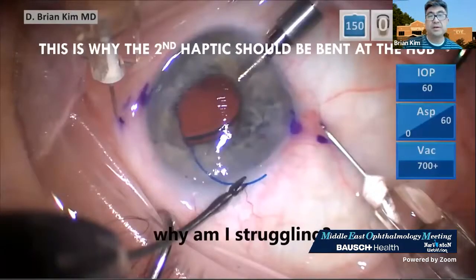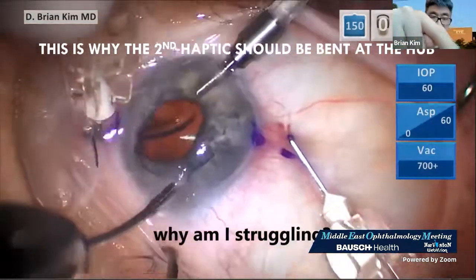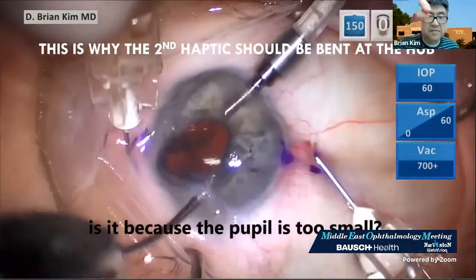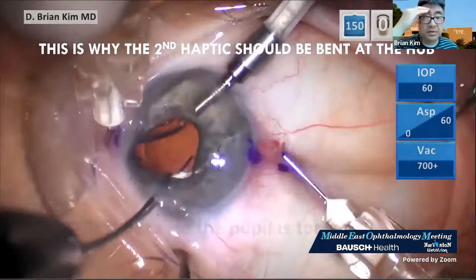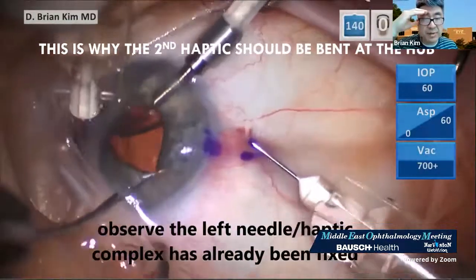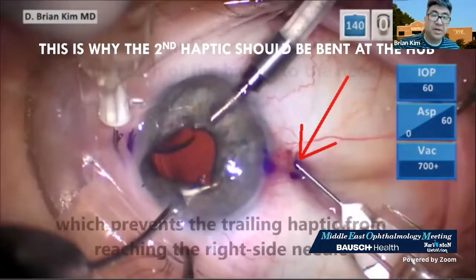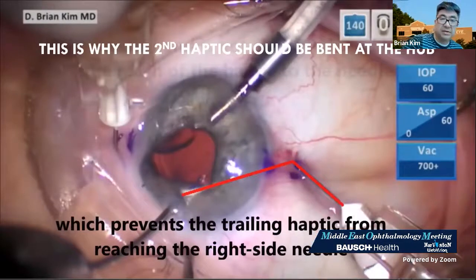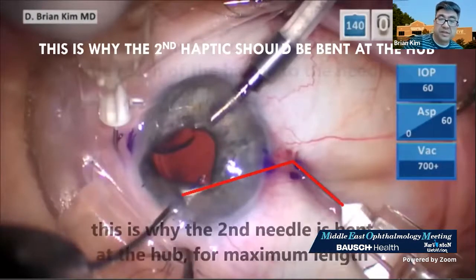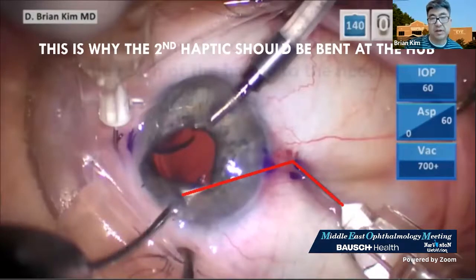So why should the second haptic be bent at the hub and not angled like the first one? You see the left needle is fixated already, but look, I bent it fairly close to the tip of the needle. And so as I'm trying to pass the trailing haptic through the right side needle, I'm having significant trouble because the left side needle haptic complex is preventing my ability to pass that right side needle through the trailing haptic.